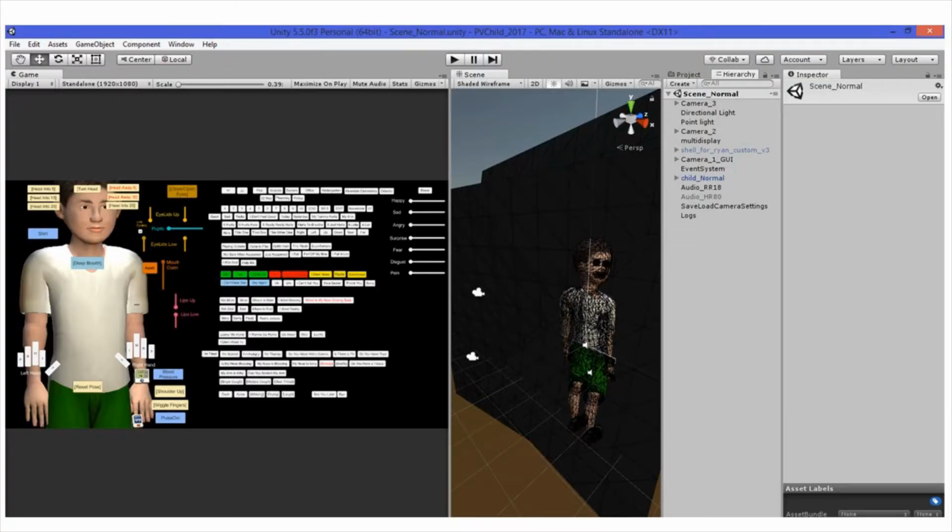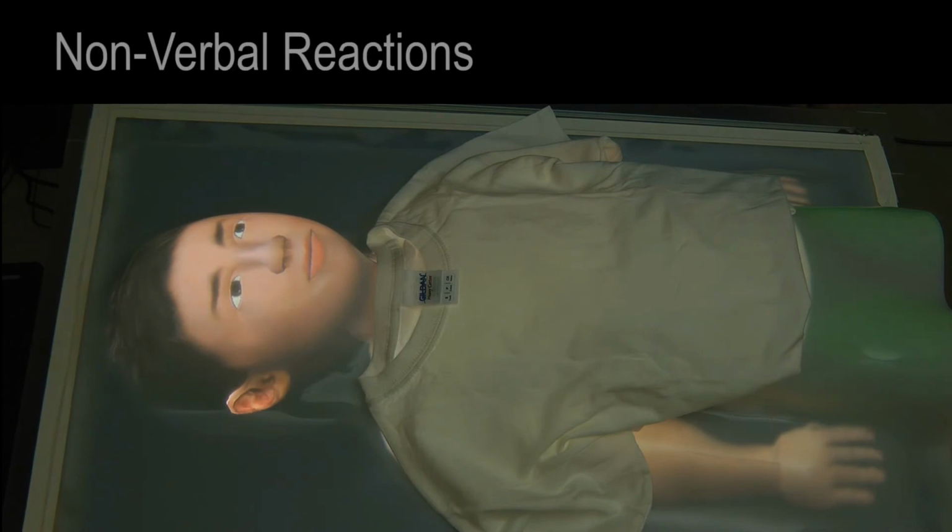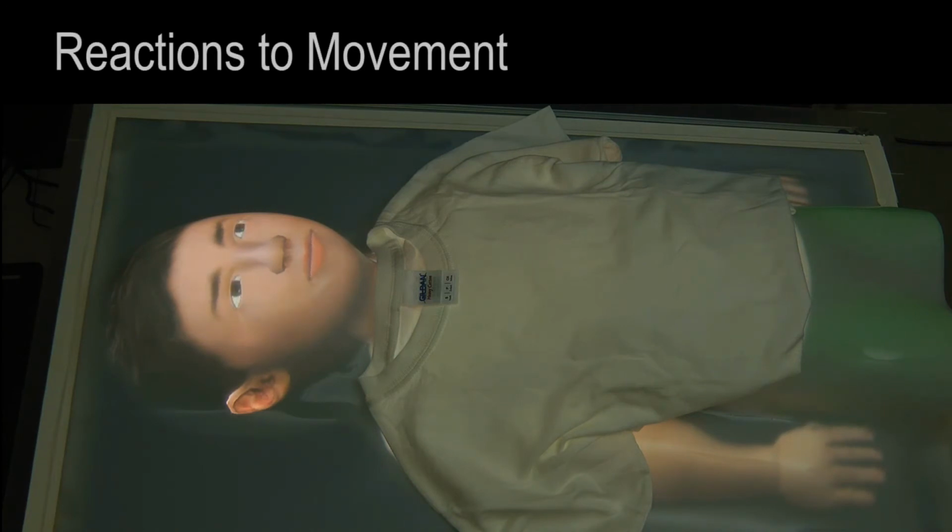Here is an example. How are you feeling today? Good. I'm going to examine your head. Is that okay? Okay. Can you smile for me? Can you frown? Can you follow my finger with your eyes?